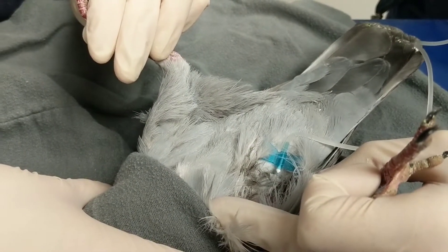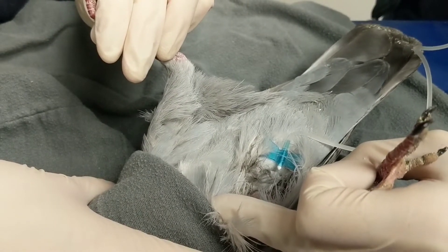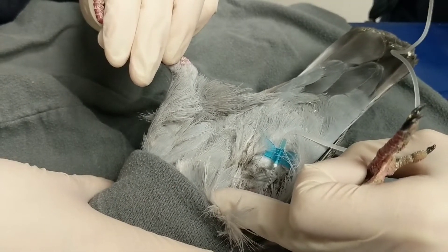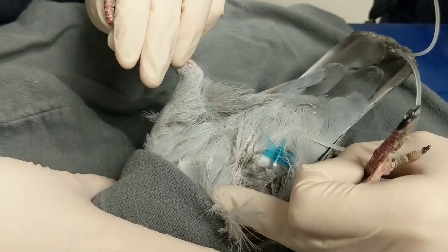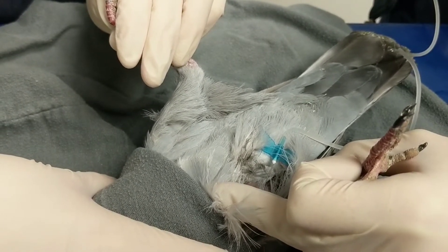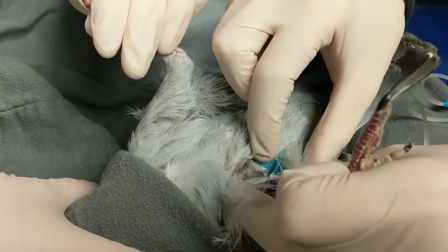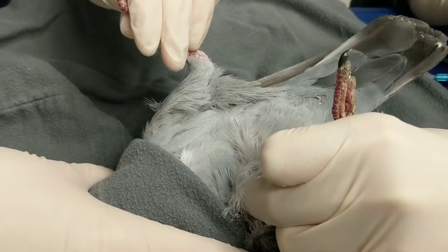And while I'm administering approximately three mils, I'm also keeping a visual eye that it's not going to get too big, because I don't want it to explode or be uncomfortable. It's actually getting pretty taut, so I might just stop there. A little bit more... it looks pretty taut, so I'm going to stop there. And then I'm going to pinch so it doesn't leak.